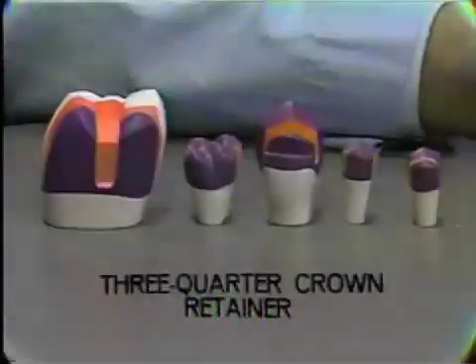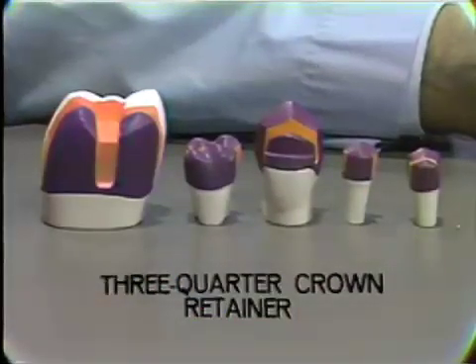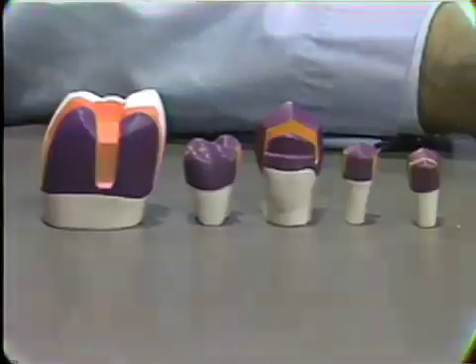As we have seen, the three-quarter crown retainer is used on both anterior and posterior teeth. At the present time, it's more extensively used on posterior teeth. So let's have a look at some examples of three-quarter crowns on bicuspids and molar teeth. Here is an example of the three-quarter crown on a bicuspid tooth.